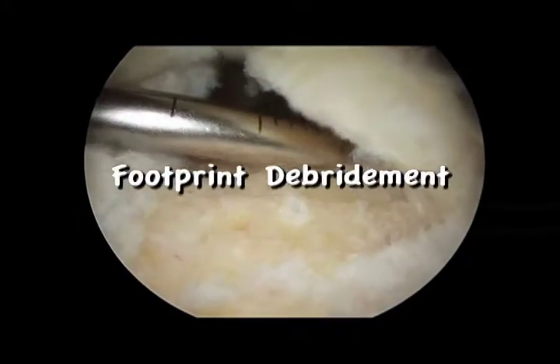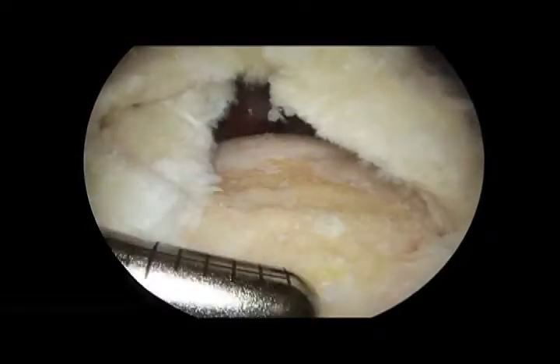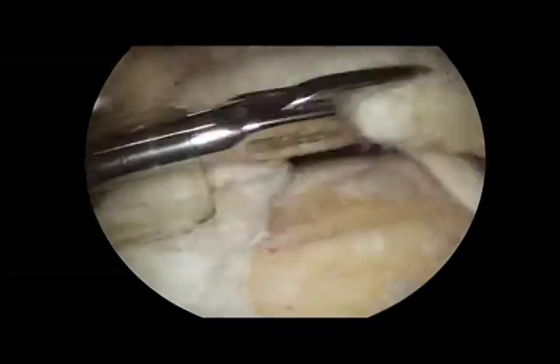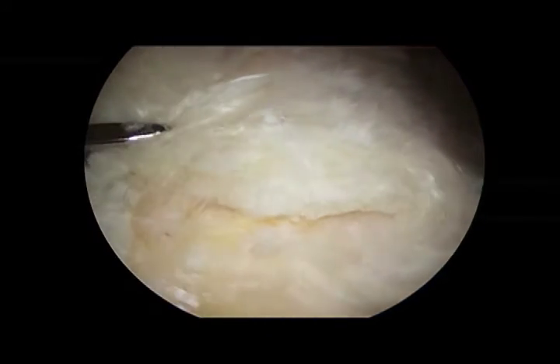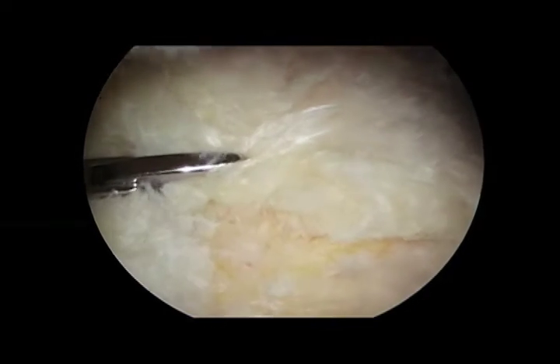We feel this is an important but insufficient step when performed alone, and we will therefore add bone marrow vents later in the case. Using a grasper, we then evaluate the tear morphology and tension when reduced to the native footprint. We elect to perform a 2-anchor repair using both simple and horizontal mattress suture configurations to address the L-shaped component of the tear and link both anchors together.